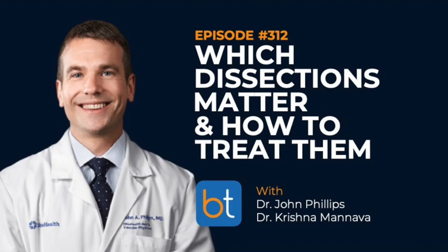And so you are pinning and pulling, but sometimes you're pushing as well on the deployment device. There are nuances; you kind of shimmy it out. And the tacks too, they can pop out on you a little bit, and that irks physicians. When I am asked to speak to reps about how to train and coach physicians through this, it's not uncommon to deploy a tack and have it go in the wrong spot. When we were involved in our clinical trials, I had some that popped out. It takes about 5 or 6 deployments to really get an understanding of the mechanism and what you're looking at. But I find that after a while, you can be quite accurate with them and place them in very specific spots and feel comfortable doing so.